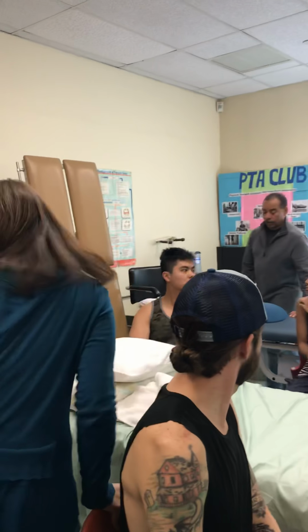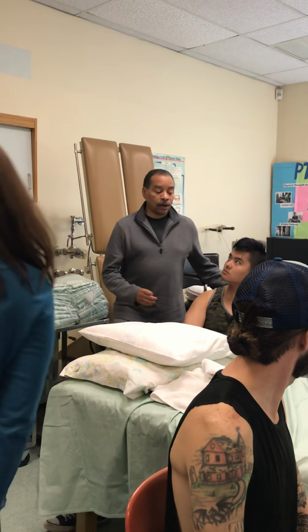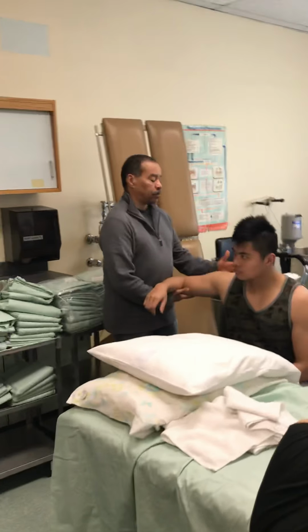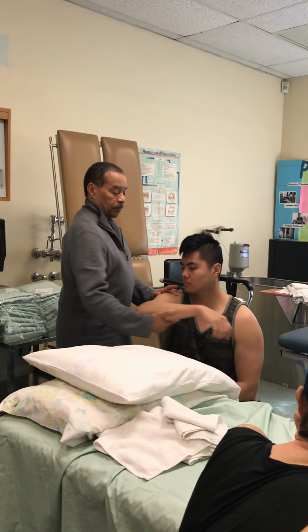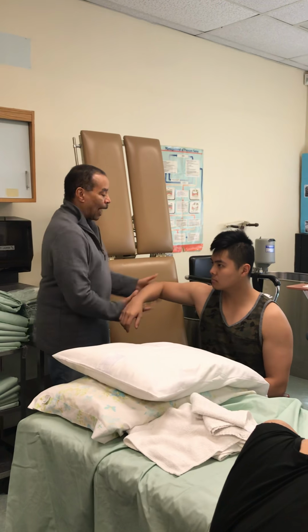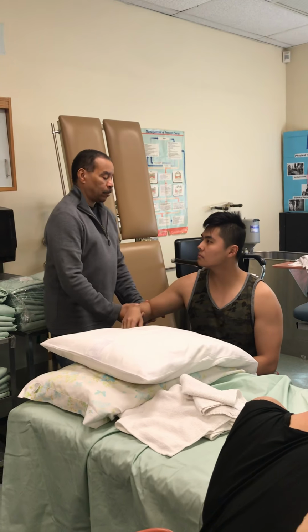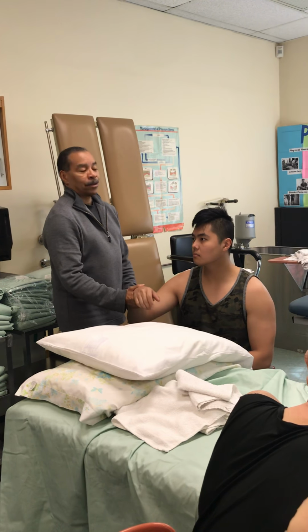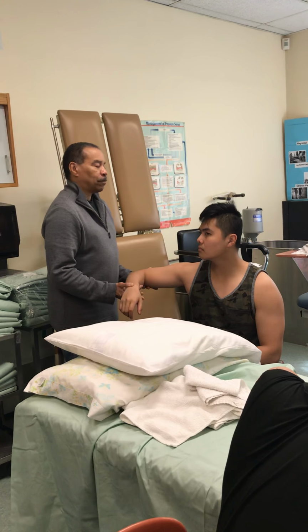And just echoing what Dr. Tom said, this is why, as one of the 3 movements you have to do first, you place the patient in the position that you want, and then you go across. I'm programming him to be at 90, as per what he was saying before. He may have more flexion, more range here, but this is anatomically not correct because you can't measure this with your goniometer. So it's just little things that you will learn this semester to keep the position that you want.